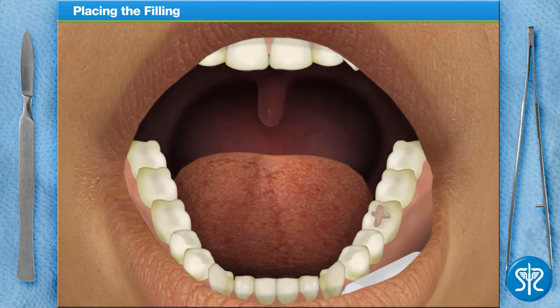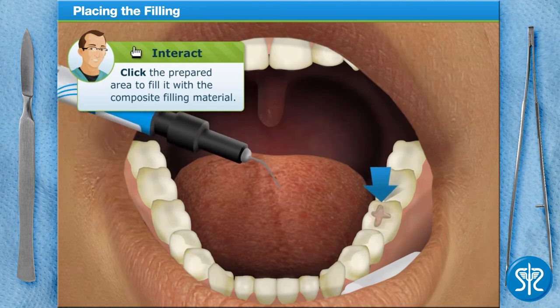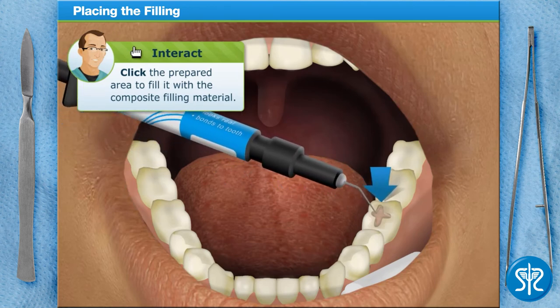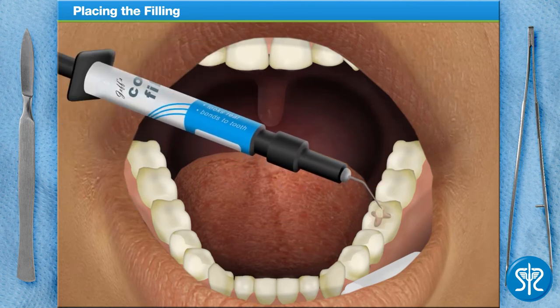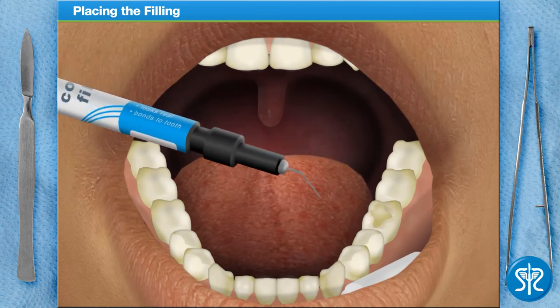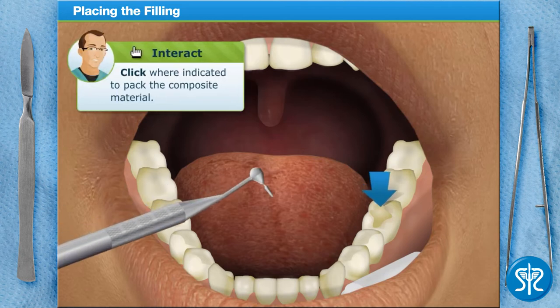Nice job — let's get a filling in there. Take the composite filling syringe and place it into the prepared portion of the tooth. Then pack the composite into the prepared area of the tooth using a condenser.